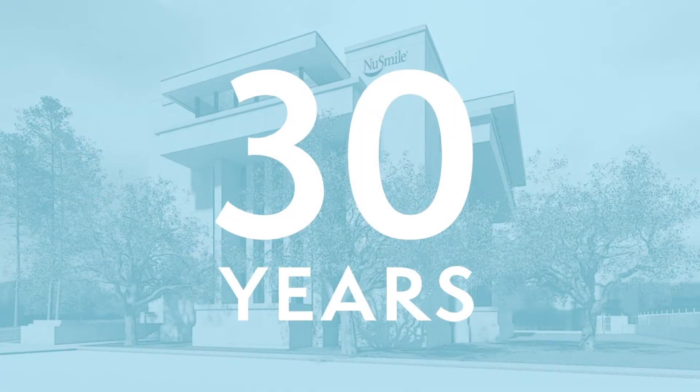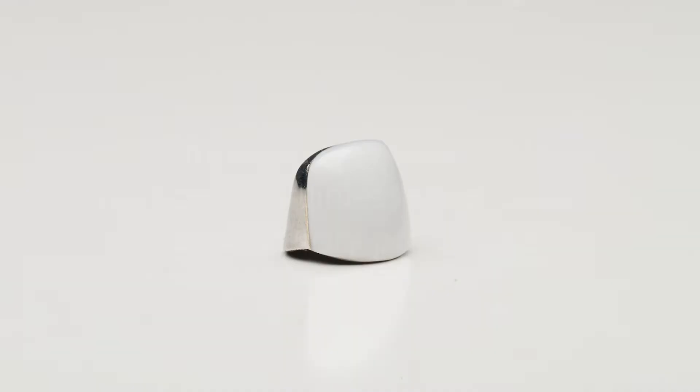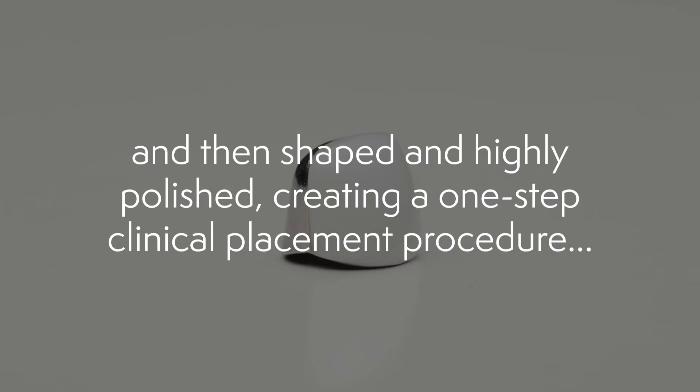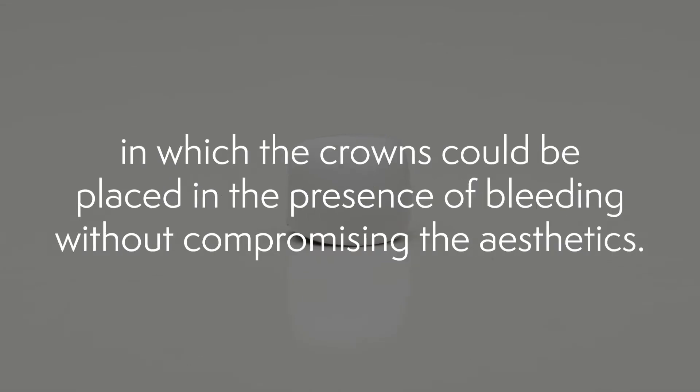But 30 years ago, NuSmile introduced the signature crown, in which the composite was bonded to a reinforced stainless steel crown in a laboratory procedure. It was then shaped and highly polished, creating a one-step clinical placement procedure in which the crowns could be placed in the presence of bleeding without compromising the aesthetics.